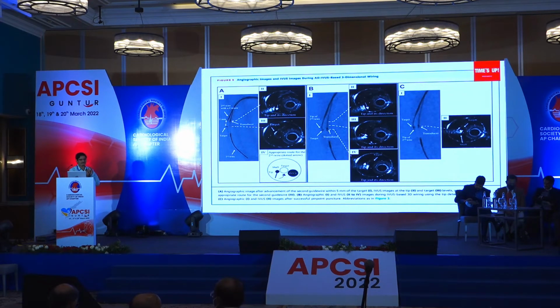So ultimately, if you have OCT, by virtue of its high resolution, it is always better and best. But in exceptional situations, you have to use intravascular ultrasound. The second is cost effectiveness. And another important thing, OCT is very sleek. Sometimes in calcific lesions you can't push. We have seen so many times, in spite of lesion modification, in angulated calcific lesions, you can't do the OCT. In that way, OCT is unable to navigate, then we have to take the IVUS. Definitely IVUS will pass through after a lesion modification. So these are the situations.